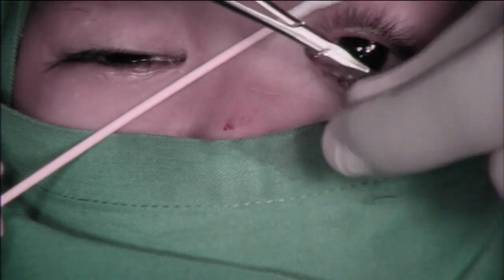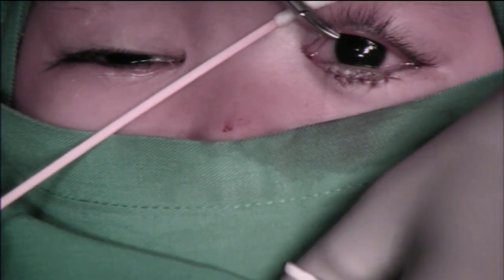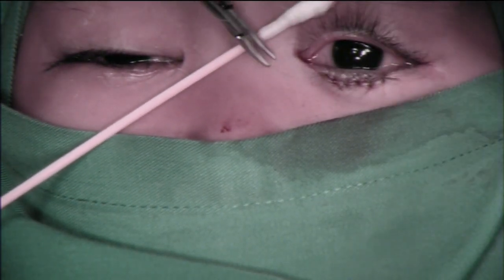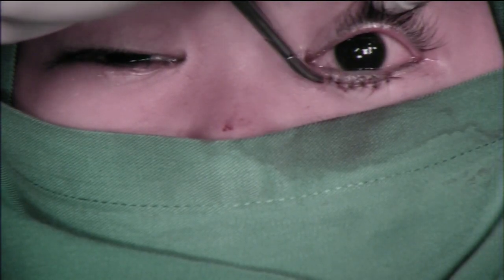At the end of your surgery, make sure that the lid margin stays in position but the eyelashes are directed outward. Post-operative care includes antibiotic eye ointment, systemic antibiotic, and systemic analgesic.